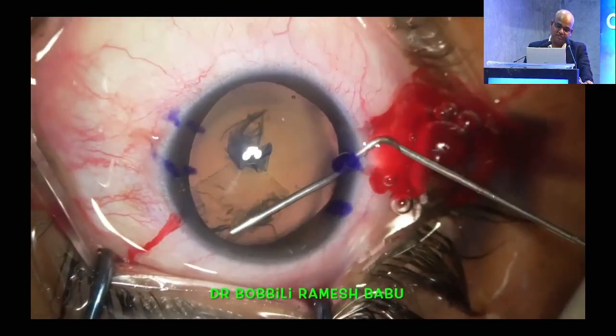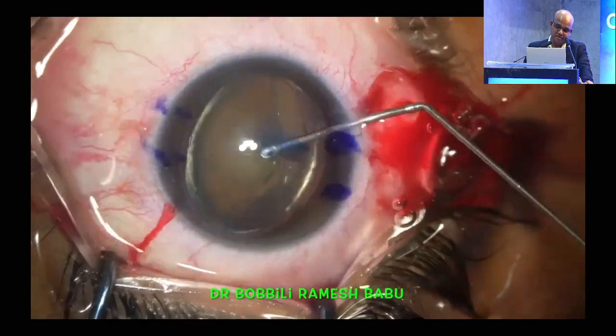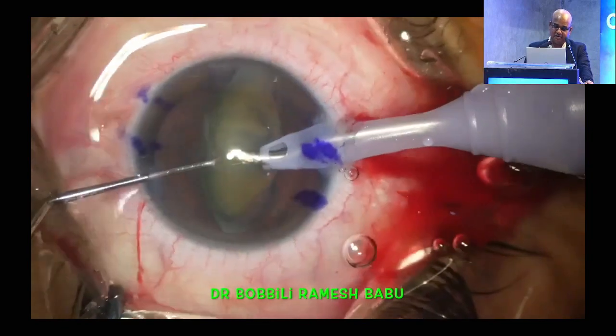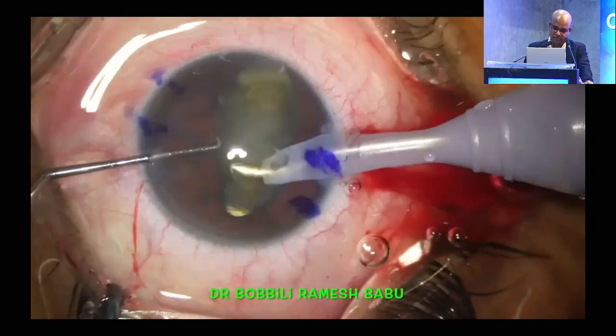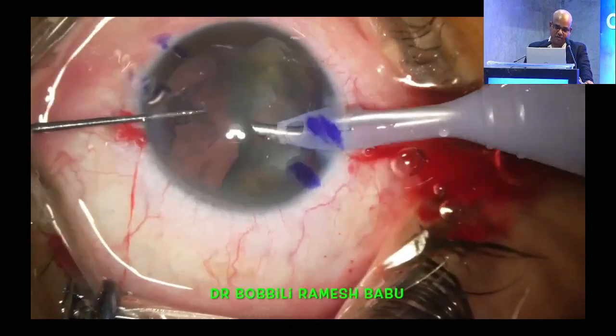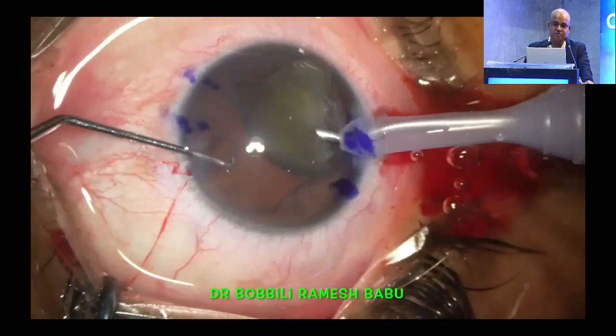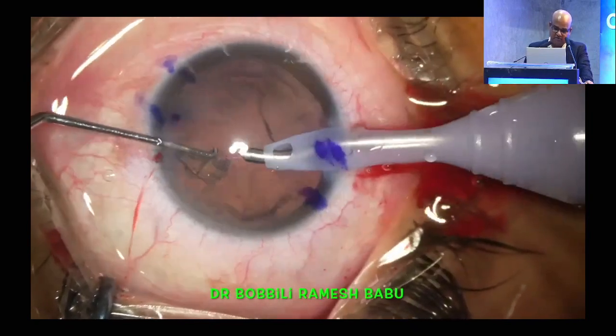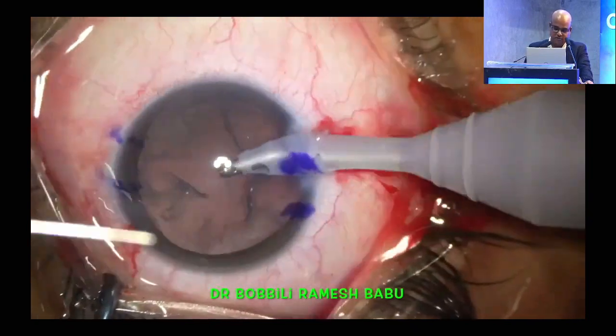So hydrodissection is done, and by flip and chop maneuver, phacoemulsification is being done. We need to protect the endothelium sufficiently, and we can protect it well with the help of dispersive viscoelastic.